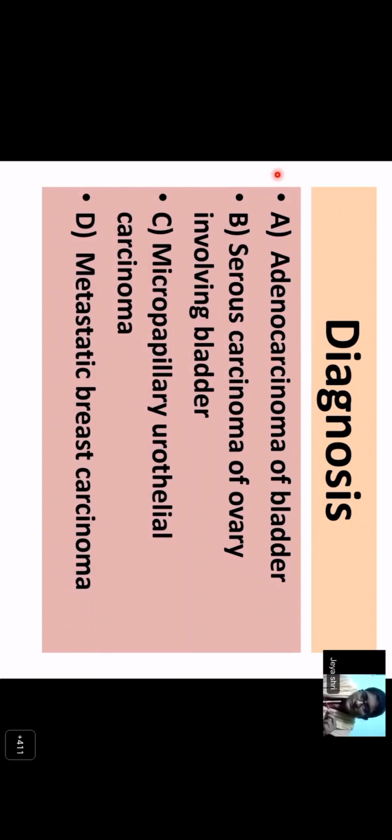In a female who has had hysterectomy for query what cause, we don't know whether the ovary was removed. You have to keep all this as a possibility in females also. So my point is, especially we have seen some metastatic breast cancers, usually lobular, which can sometimes have these aggregates within the lamina and can look like urothelial cancer. And mind you, a breast cancer is also GATA3 positive along with urothelial. So you have to keep these things in mind.